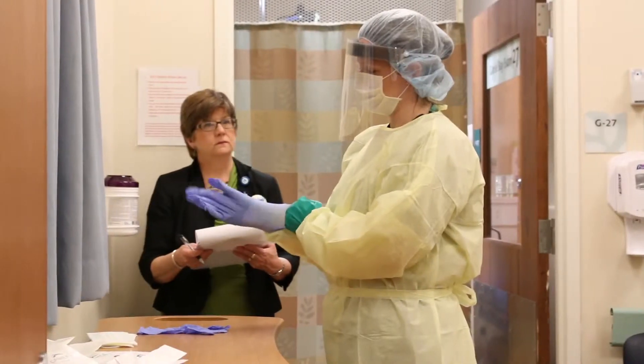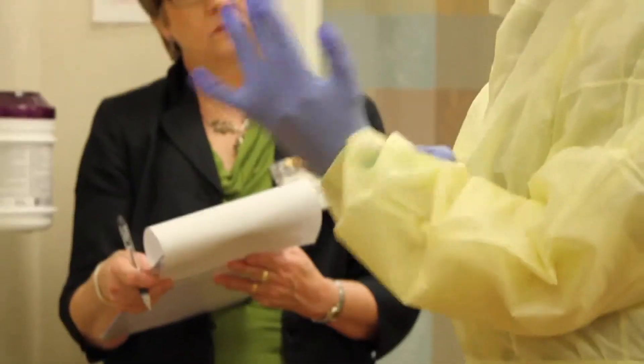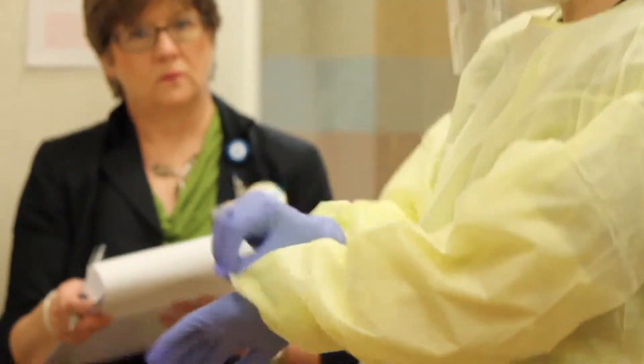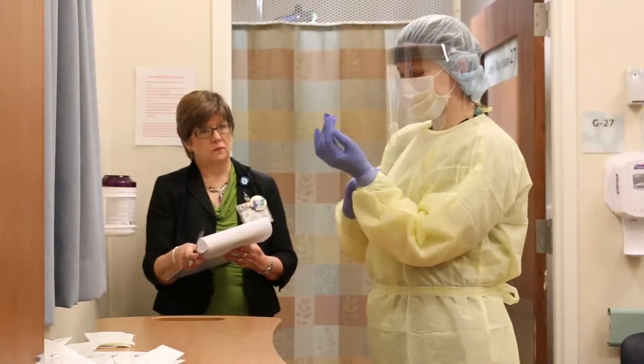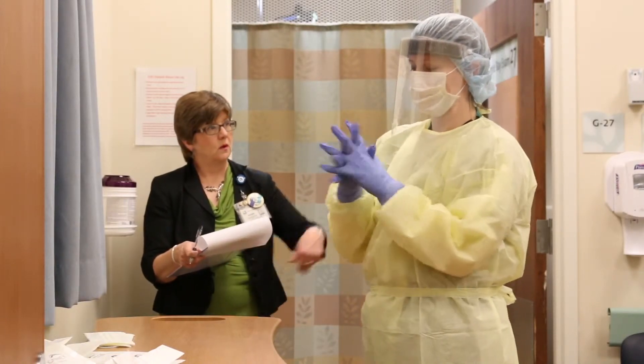Put on the second pair of gloves — these are the exam gloves and they should be tight-fitting. Extend the wrist of the gloves over the cuff of the outer gown. Your safety officer will record your donning time and then you are ready to provide patient care.